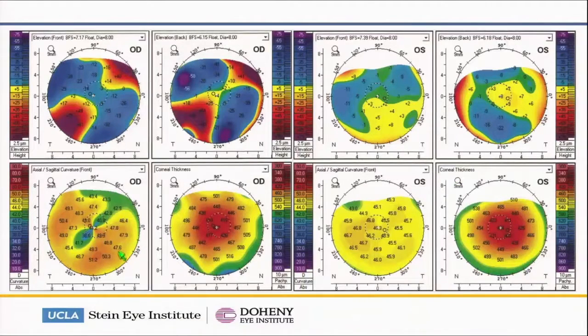Tomographic imaging of the right eye demonstrates this infratemporal steepening, as we see here. And in both eyes, on the pachymetry map, we can see that there's not just central thinning, but there's actually global thinning, with these peripheral pachymetries only maybe high 400s or so in each eye.